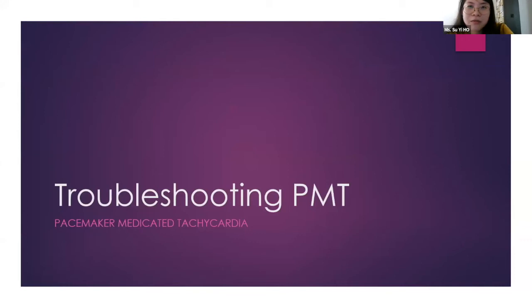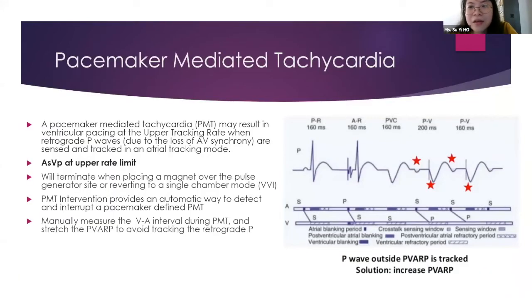Okay, so towards the last part, one of the troublesome things that I face is actually episodes of PMT, which is pacemaker mediated tachycardia. It is sometimes seen in certain patients, especially those with intact VA conduction. Pacemaker mediated tachycardia, also known as endless loop tachycardia, is actually a reentrant tachycardia caused by the pacemaker when they are tracking in the dual chamber tracking mode.